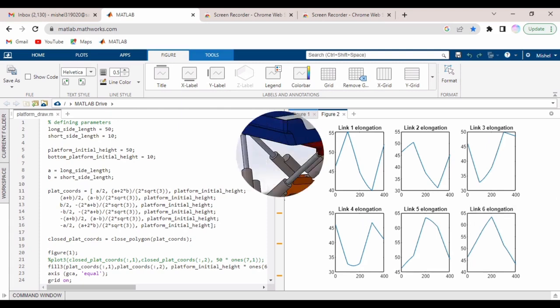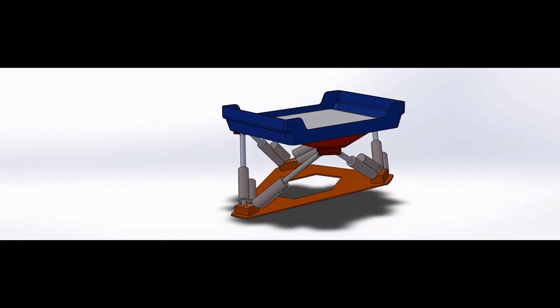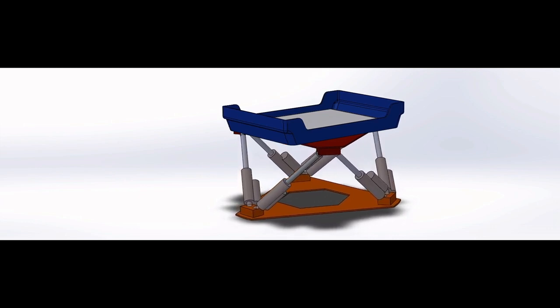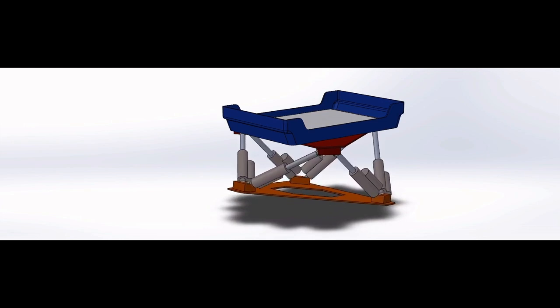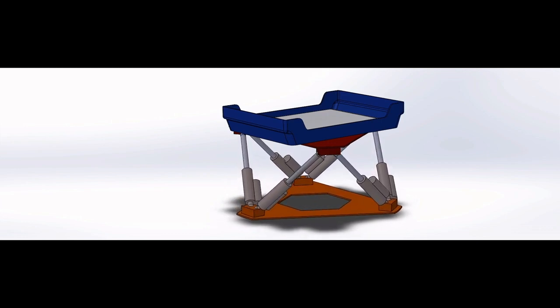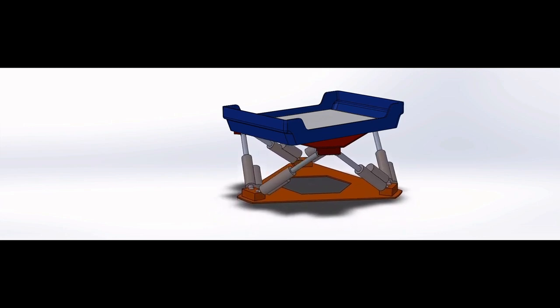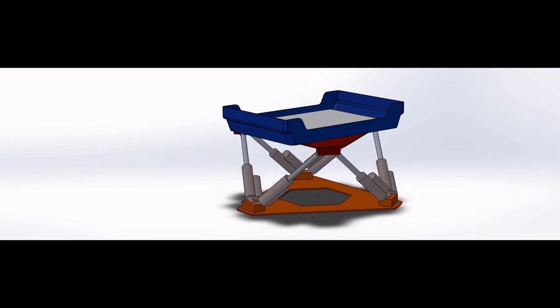Hence, the system was analyzed and the final design of the prototype was developed using the SolidWorks platform. In this video, all the possible movements of the system are demonstrated. The top platform of the system where the incubator with the neonate is placed is always maintained stable irrespective of the movements of the vehicle, thus isolating the mechanical shocks transmitted by the ambulance floor to the incubator.